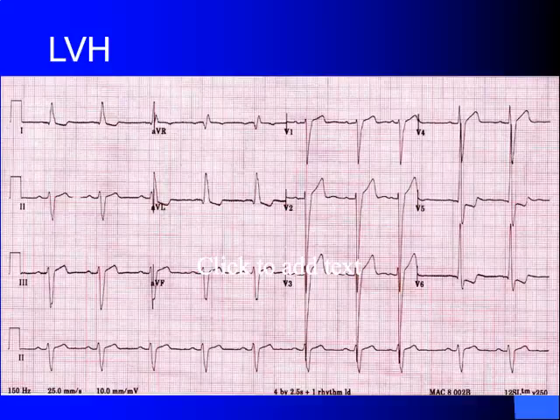It's kind of hard to tell, but the QRS is overprinted into V4. But if you notice, it looks like it's about 35 millimeters in height just by itself. It goes all the way up to the isoelectric line of V4. So we're looking at well over the threshold for this to be considered left ventricular hypertrophy. That's really the point to drive home here.